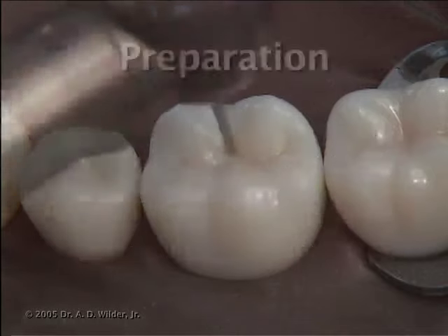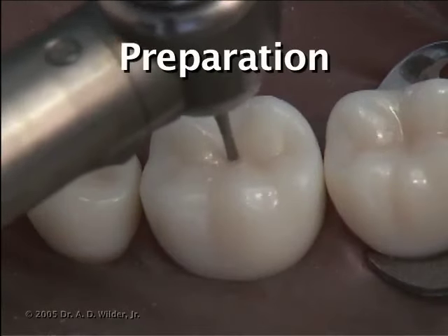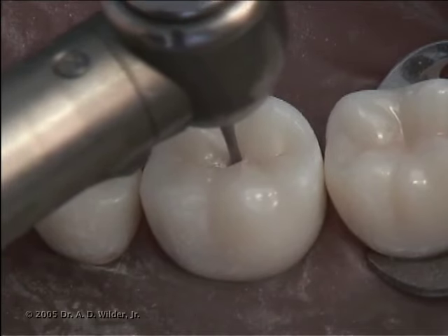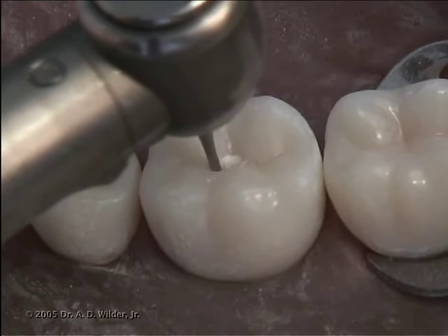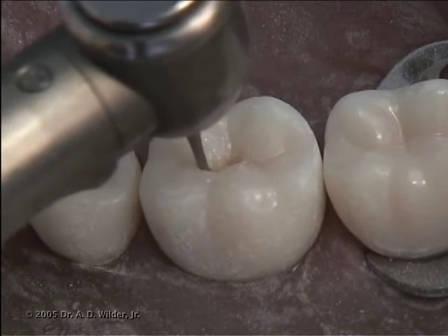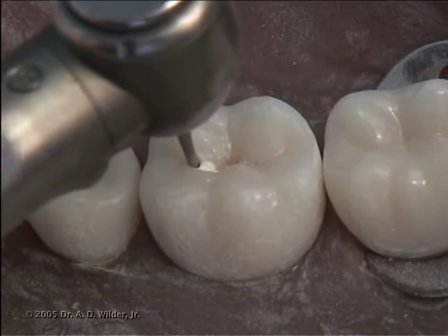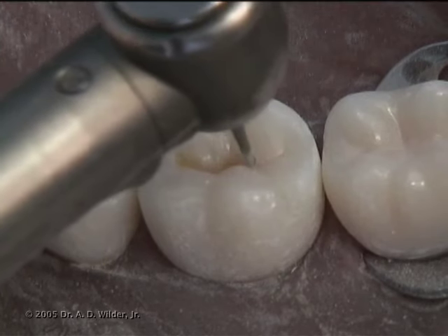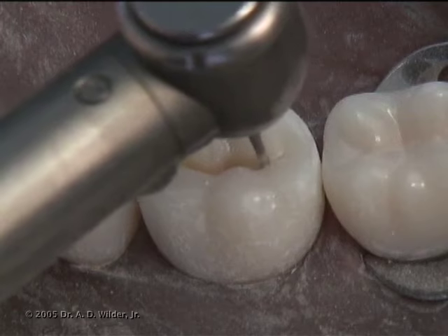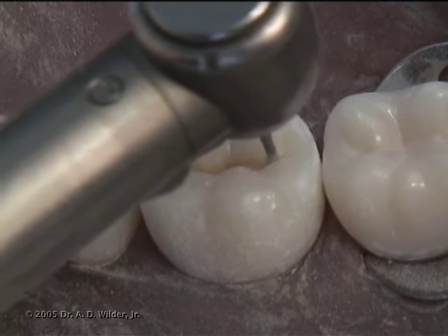First, we want to utilize a carbide or diamond burr in a high-speed handpiece to create the initial punch cut where the caries is the worst, usually at the central pit. A good guideline is to drop somewhere between half and full length of a 245 burr, which is just shy of 3 millimeters in length. This will put you just inside the dentin layer on an average occlusal surface.